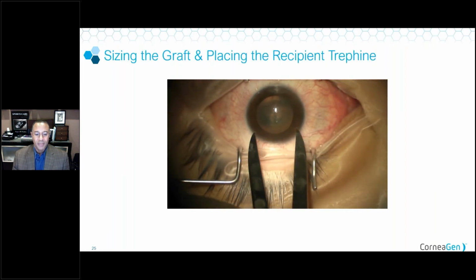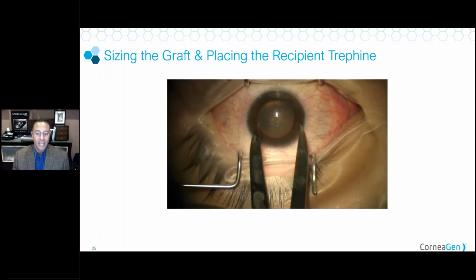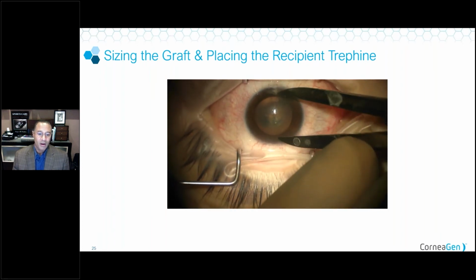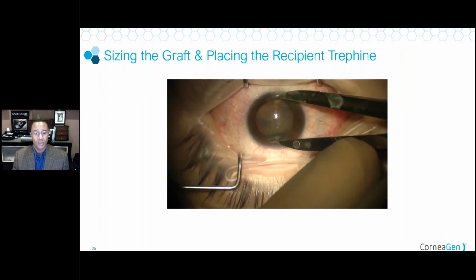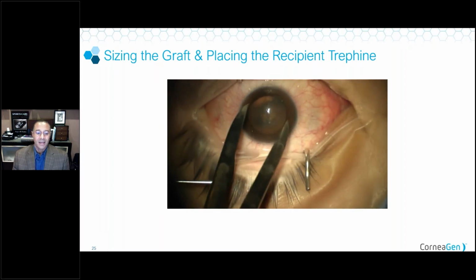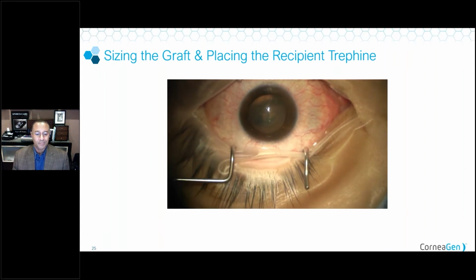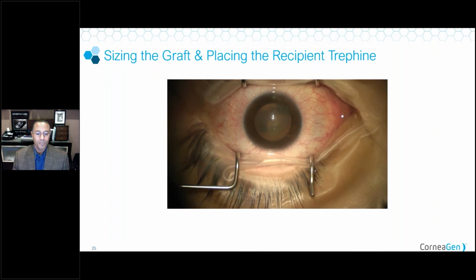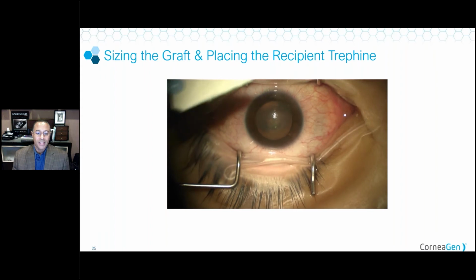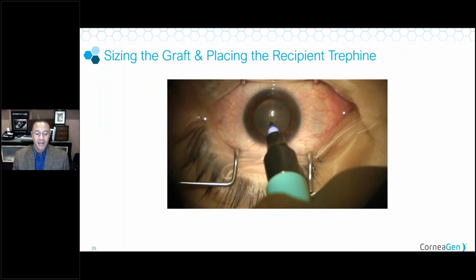After that, I'll take my 8.5 millimeter calipers and measure out where the edges of my graft are going to be so that I have a rough idea of where I'm going to land. In cases where we may be doing, say, a herpetic scar where there's vascularization, or some other type of scar where we may impact other opacities or problems in the peripheral cornea, it's good to know where you're going to end up. And then once we do that, I use a gentian violet pen to mark my center so that when I'm placing the trephine, it's easier to see. And I'm kind of committed to that center point.